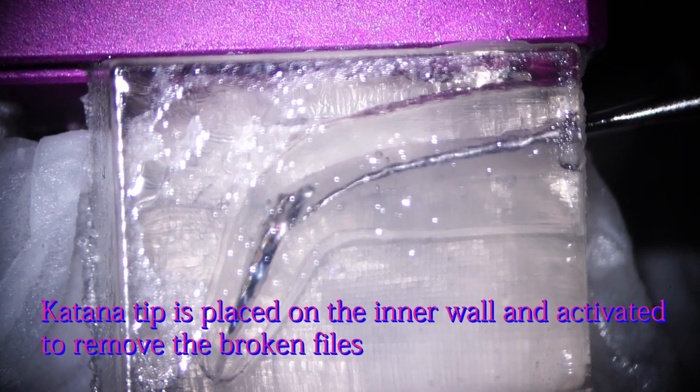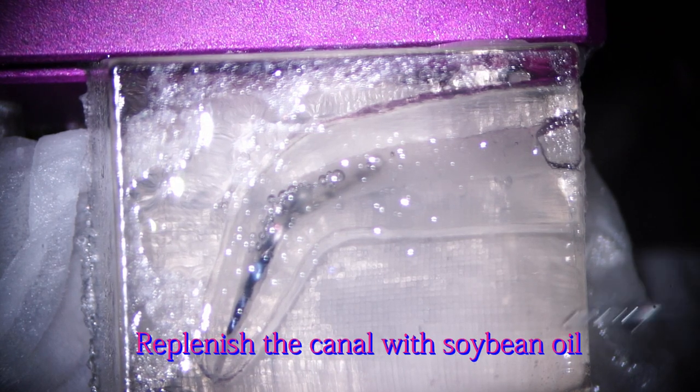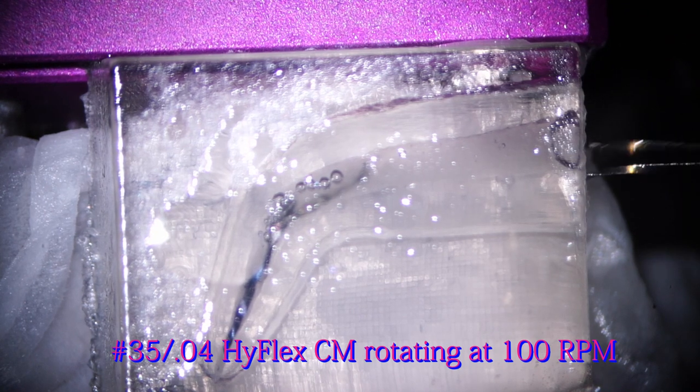There are two more broken instruments in the root canal. Two of them are already dancing with ultrasonics. I need to replenish the canal with soybean oil to lubricate the broken instrument. I'm going to try the XP-endo shaper rotating at 100 RPM. However, it doesn't do anything to get the instrument out. So I'm going to change to a number 35-04 HIFLEX CM instrument rotating at 100 RPM.